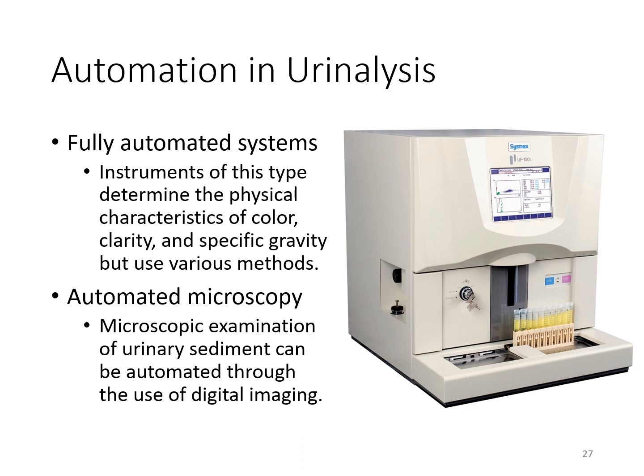And then you also have machines that do automated microscopy. A lot of hospitals are starting to get these instruments in, so it's a very good chance that you'll get to see this when you go to clinical, where the analyzer itself will take pictures of the formed elements and it will put them into a category, and you'll get an actual number similar to a CBC.